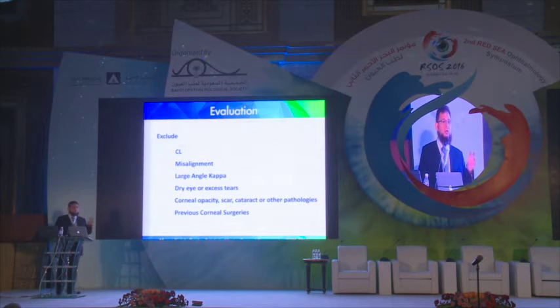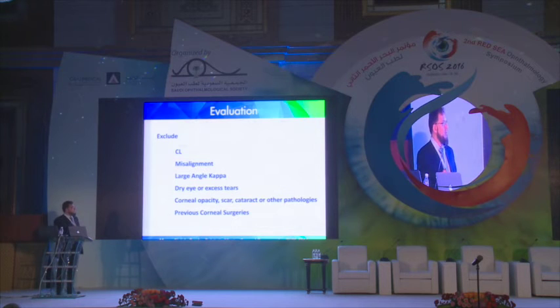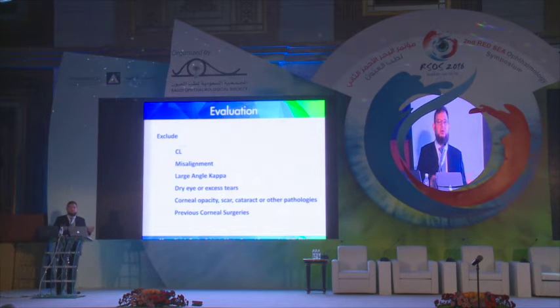Before you judge that this case can go into surface ablation or LASIK or something else, whenever you have such abnormalities, you have to exclude some factors that may mimic such things, like if the patient is using contact lenses for a long time and he has just removed the contact lenses just before coming into the clinic. So there will be a very high warpage of the cornea. So in this case, we have to stop contact lenses for at least 1-2 weeks. And there is a rule that says 1 week for every 1 year of usage in order to retain the normal shape of the cornea before judging.